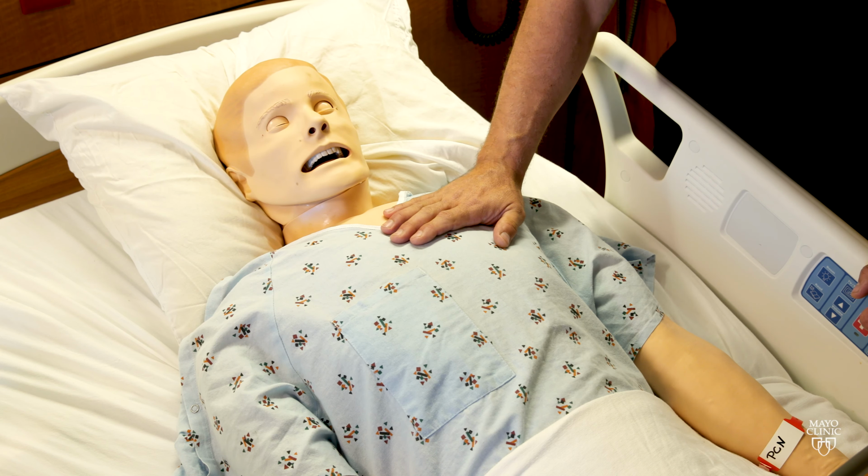I want to know about this. It looks very cool, but clearly there's a purpose behind it. So this is the Anatomage Table. It's a virtual dissection table. And what it does is it allows us to take a thin slice CT or an MRI and create a three-dimensional object. So this is a full three-dimensional rendering of this particular patient. This is not just some random thing. This is a specific case, a specific patient that you guys have treated here, right?